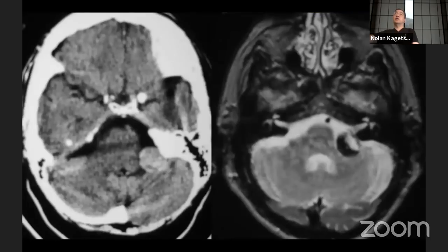Okay, this is another case. So this is a CAT scan. We can tell because the bones are dense, and we can see this lesion in the posterior fossa in the cerebellopontine angle. And this is an MRI, a T2, because the CSF is white, and we see this same lesion, and it has kind of dark signal and bright signal.